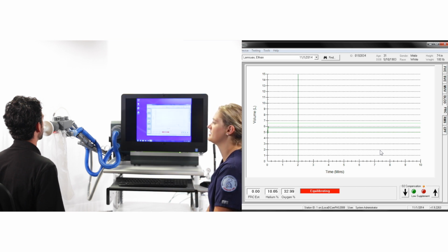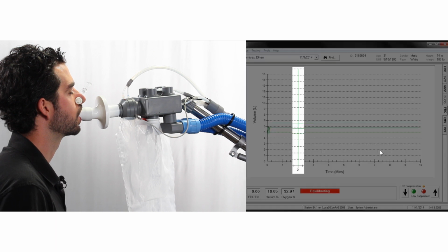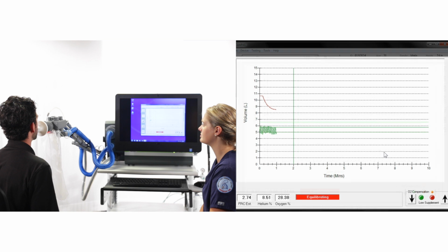From this point onwards, the display of volume is coming directly from the spirometer. Helium dilution studies usually take between 3 and 5 minutes to perform, so encourage the subject to relax and just breathe normally. In Compass, there is a line drawn at 2 minutes, which indicates the minimum time allowed to run an FRC study. After a minute or so, observe the tidal breathing pattern on the screen.